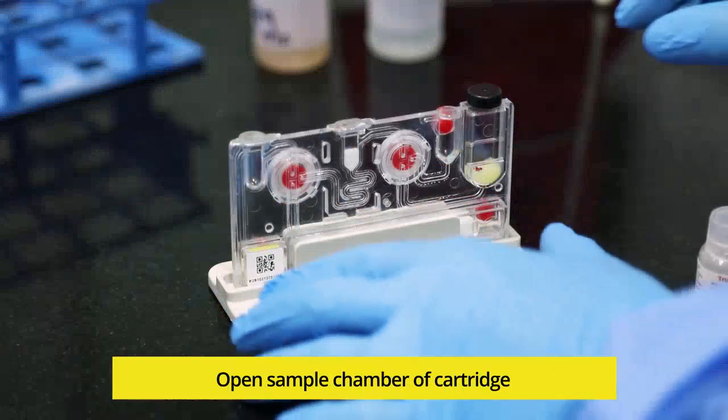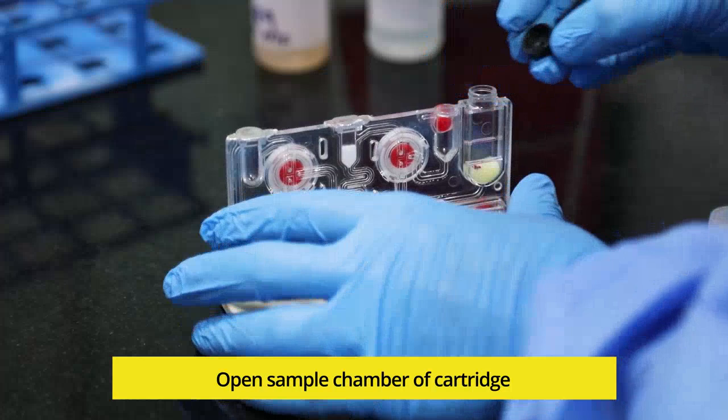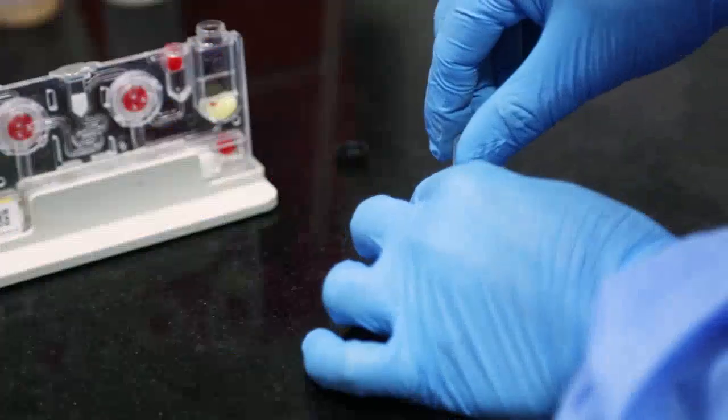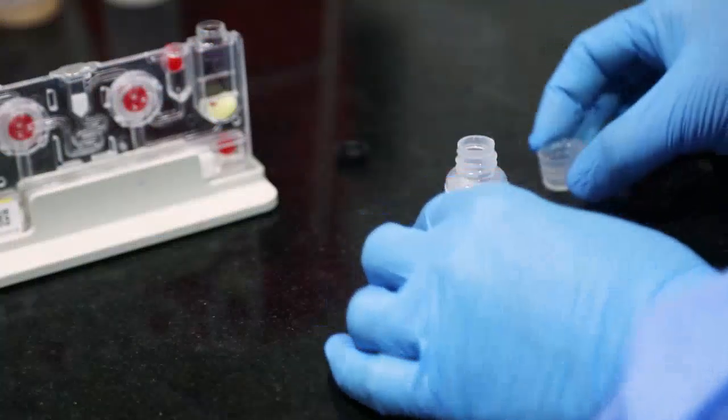Remove the cap of the sample chamber of the cartridge. Now all the content — approximately 3ml from the Lysis buffer bottle — should be transferred to the sample chamber of the cartridge.